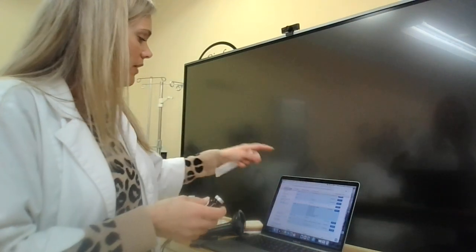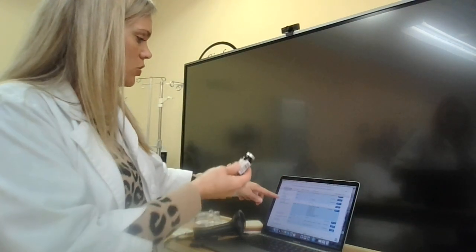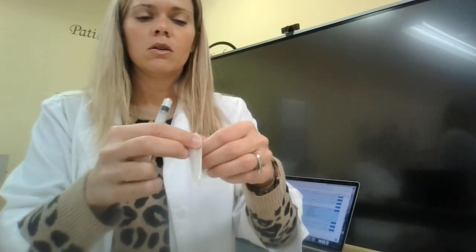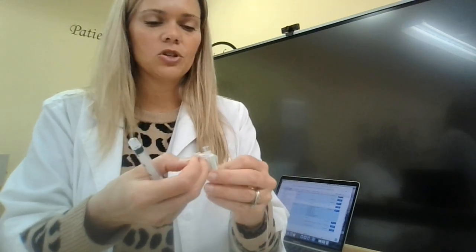Okay, so I've got Chris Jones for furosemide, 20 milligrams, IV push at noon. I'm going to go ahead and wash my hands before I draw it up. I always think about with IV, you really want to make sure that there's no air bubbles in the line because, if you're directly putting it into their venous system, you don't want to be injecting any air. Same thing, keep that end sterile. And if you contaminate it, no big deal, just get a new one.